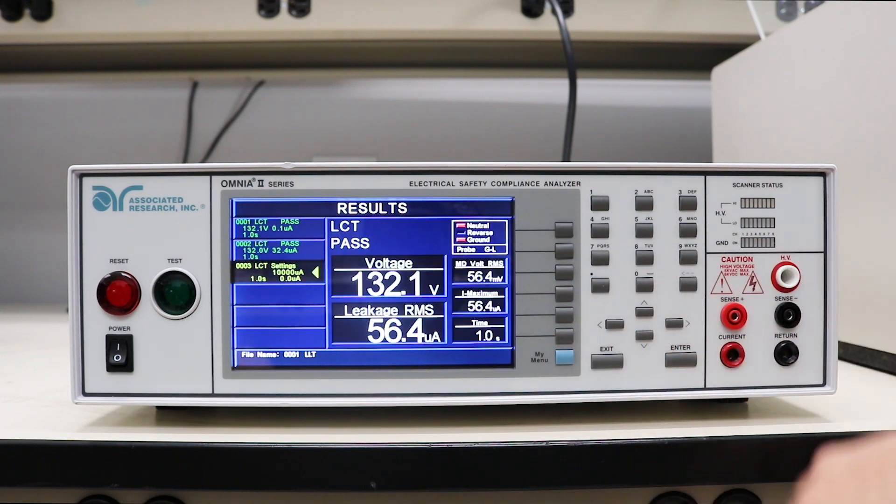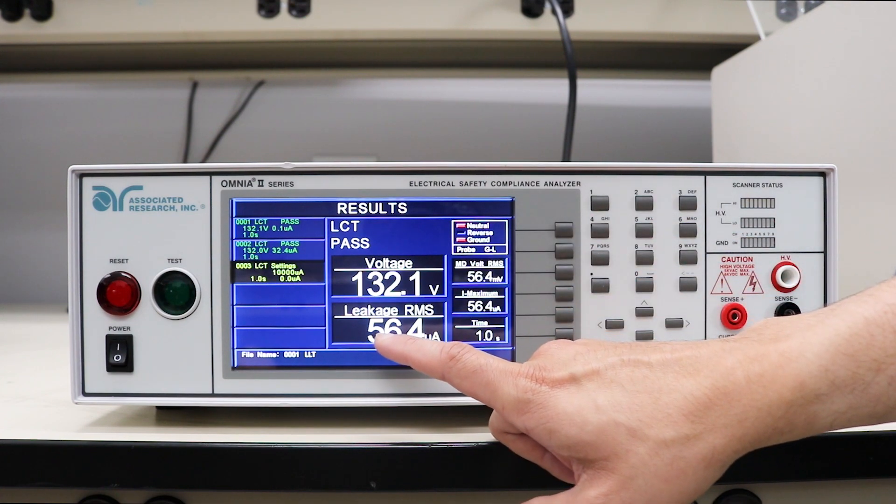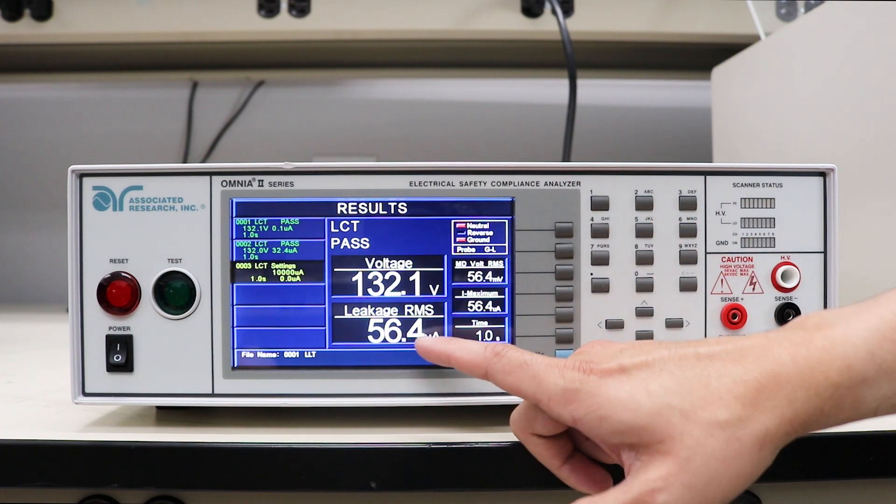In the last test step we have our neutral open as well as ground open. Look at the leakage current reading: up to 56.4 microamps.